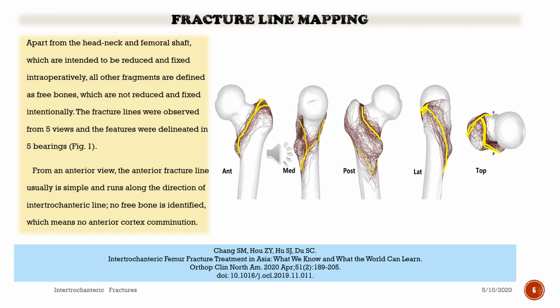In this study, fractures were evaluated in three-dimensional CT, and we look at the established fracture lines: anterior, medial, posterior, lateral, and top of the proximal femur. You can understand and realize the fracture pattern.